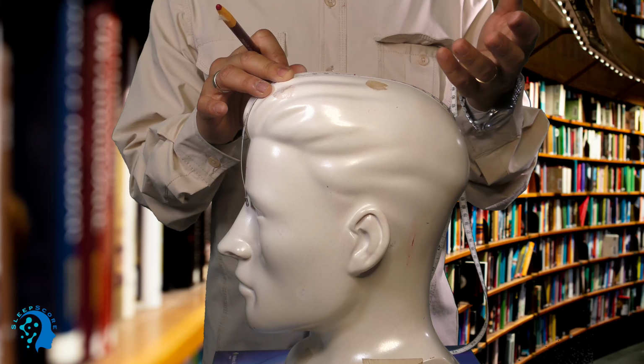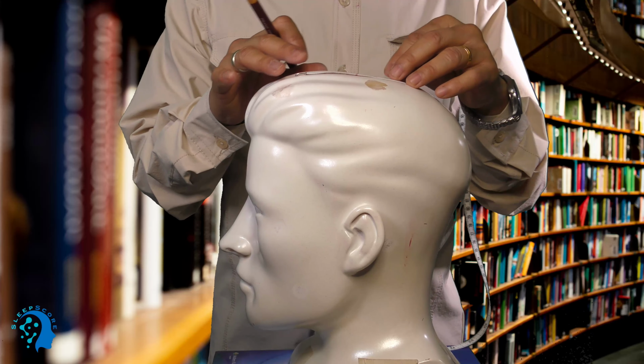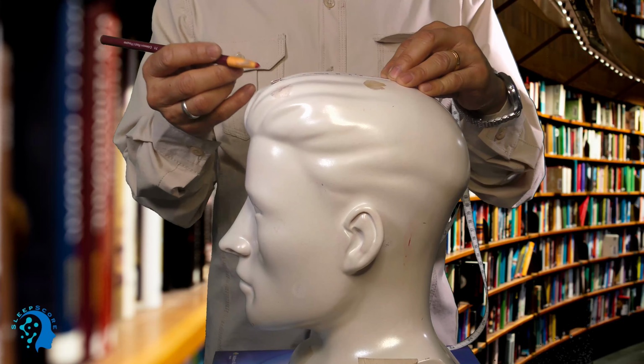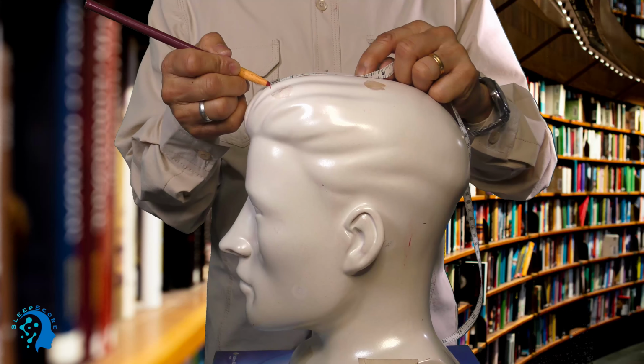Double of 38 is 76, so I take 7.6, which is right here. So this is 7.6. What I did, I went from the center, from here, 7.6 down, right here.